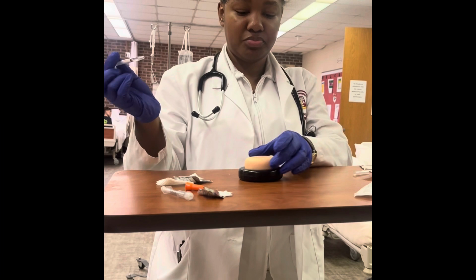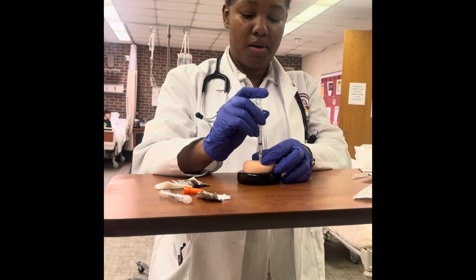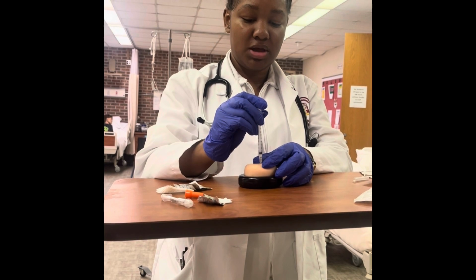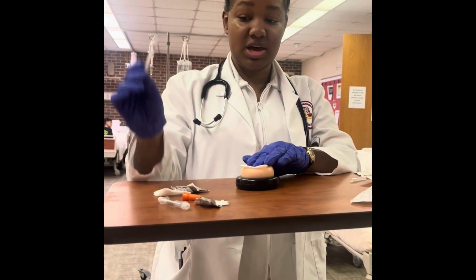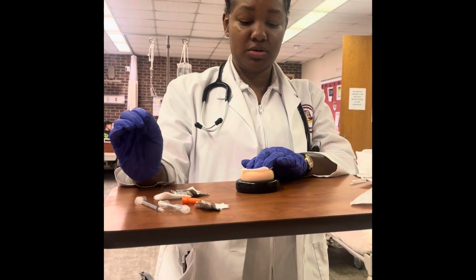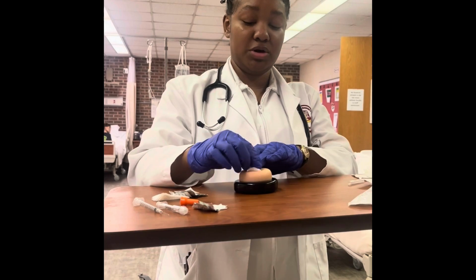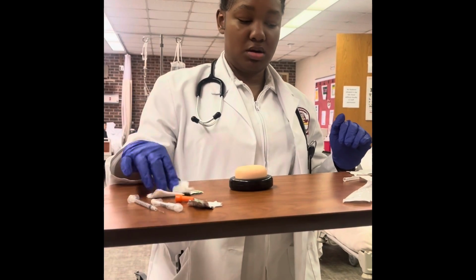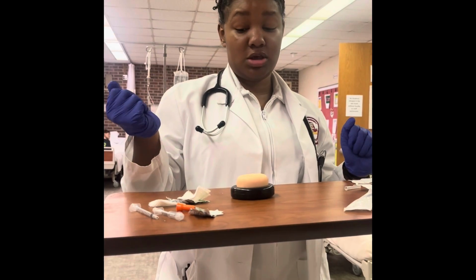All right. You're going to feel a poke. Slowly inject the medication. Again, apply pressure. Don't massage the site. Throw this needle in the sharps container. And then I could tape down the gauze or put on a bandage in case of bleeding. All right, I'm gonna pull your shirt back down. I'm gonna lower your bed back down. You need anything else? No? Okay, thank you.